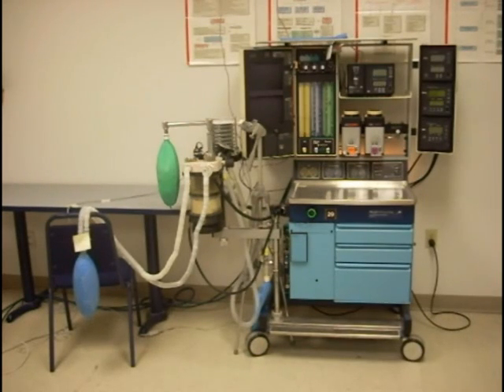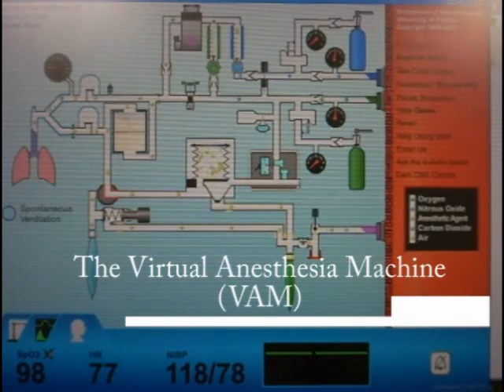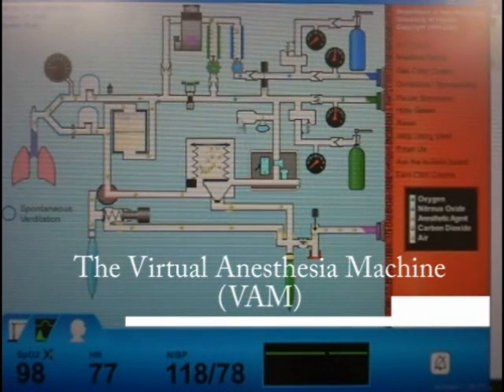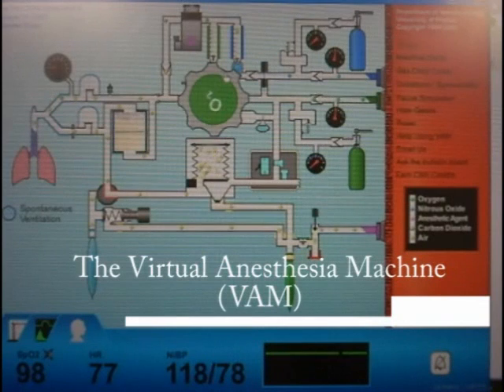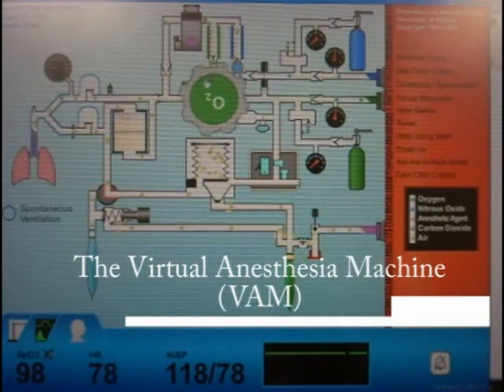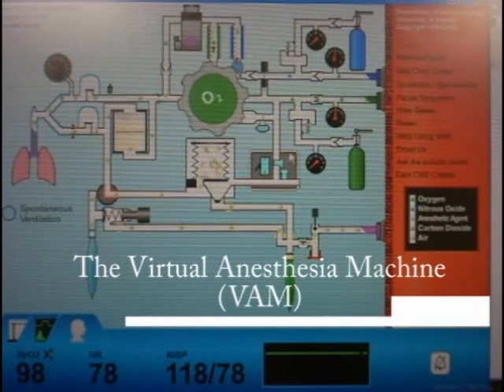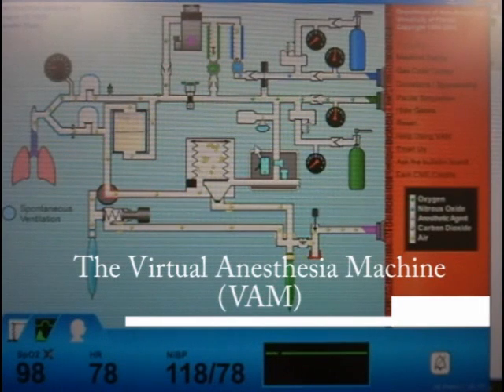Simulations like the Virtual Anesthesia Machine, or VAM, are widely used to teach abstract concepts. In this case, the VAM teaches abstract anesthesia machine concepts, such as invisible gas flow.